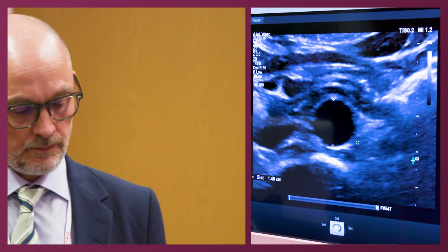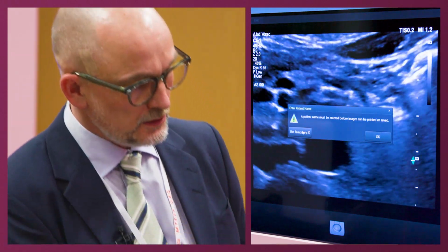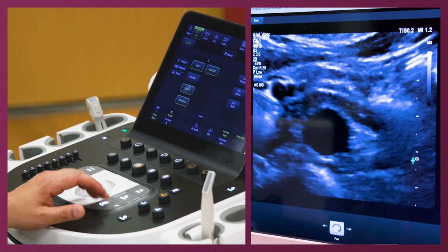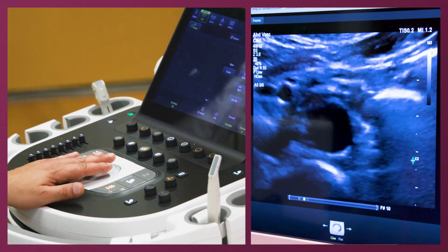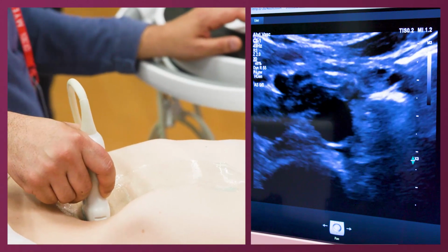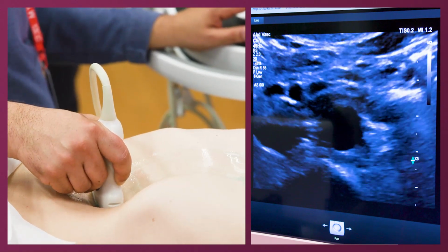Okay. So you take a clip and then you find the frame. And it's very easy. Just freeze, and you have 300 frames. So we simply do that, and you do it in systole. And one of my favorite questions is, if you measure the diameter on a CT scan, is it systole or diastole? Nobody can tell me. No. It varies. Exactly.